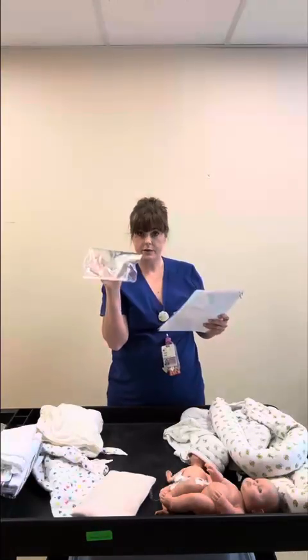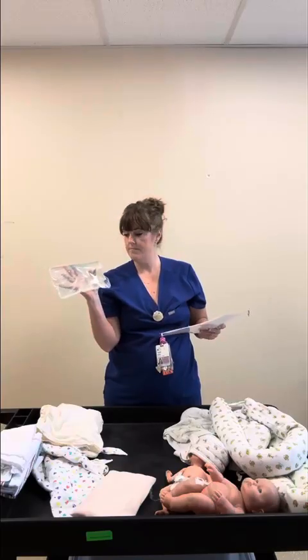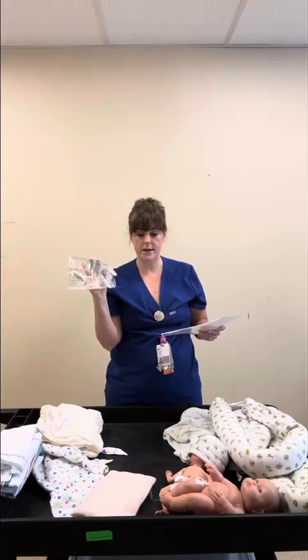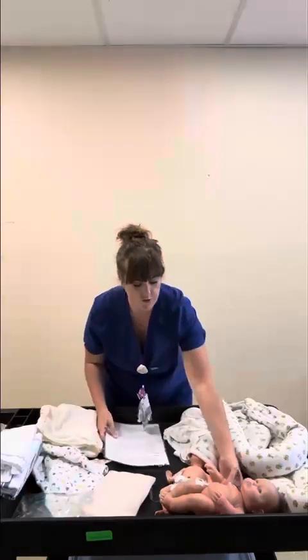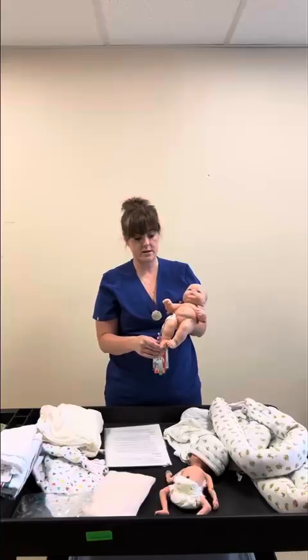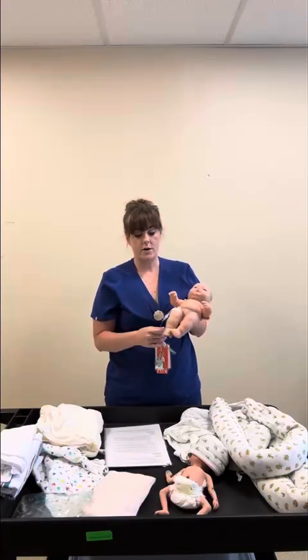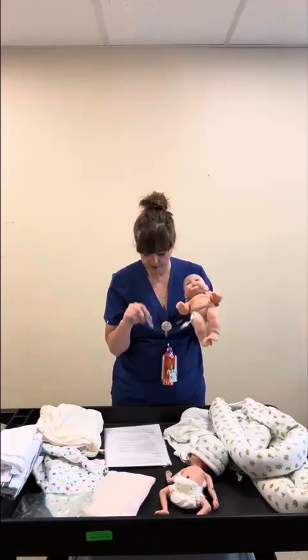Again, gel pillows not for supine. And then once they're out in a crib or bassinet and you don't have an order, this is chilly. So they don't really need a squish-on gel pillow unless you've got an order for like a head issue. Still make sure that you can visualize this IV for your hourly checks. So that means probably not dressing this baby in a sleeper, leaving this leg out for swaddles. Pretend this is a PIV and not a PICC also.